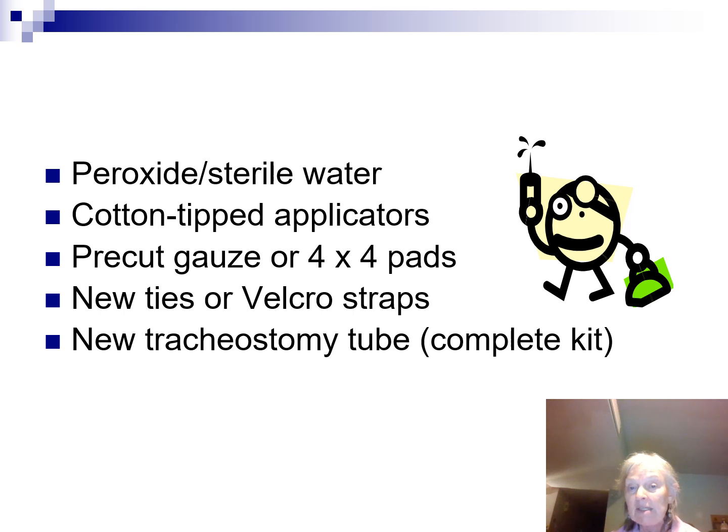Do people cough these out? Matter of fact, they do. We had a patient who came in our hospital one time, and he was having a terrible time with his trach, and he was coughing and coughing, and every time he coughed, he was moving the trach out just a little bit. They were trying to get the physician to come and take a look at it. The physician was tied up somewhere else. Finally, what happened is the patient took a very big cough, and he actually coughed his trach out.